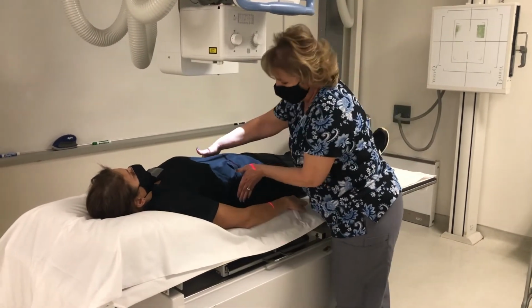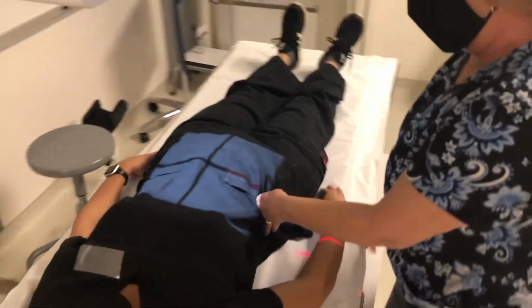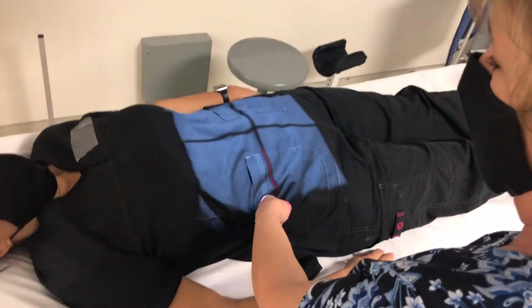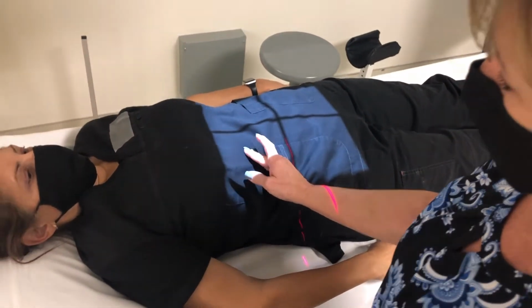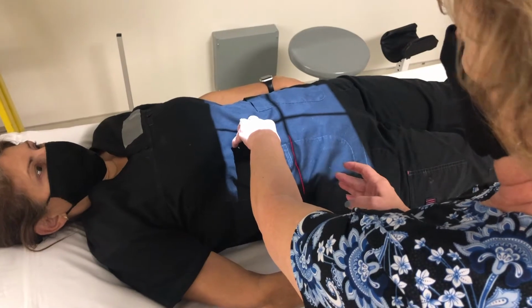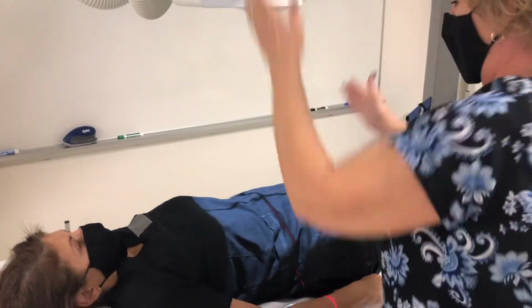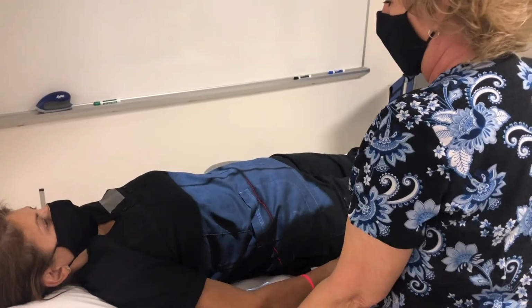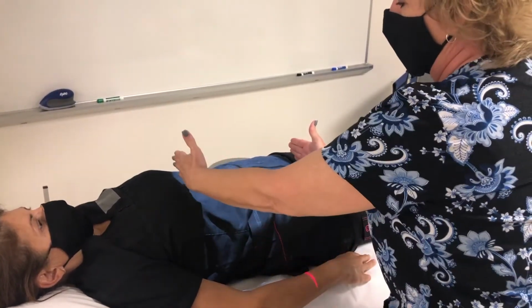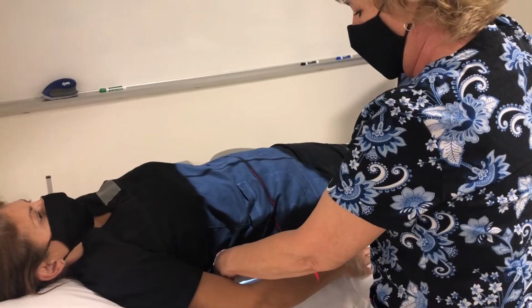Okay, I'm going to press on your waist here. I'm going to feel for the top of the iliac crest, and I'm going to center right at the crest. Her kidneys are probably located right around the last rib, which I feel here, so I'm pretty confident that I'm going to see her kidneys and her bladder. If you weren't quite sure, you could raise up your SID just a little bit. And now definitely I'm going to include bladder and kidneys on here. So that's what I'm going to do here. I'm open a little bit wide, so I would collimate down.